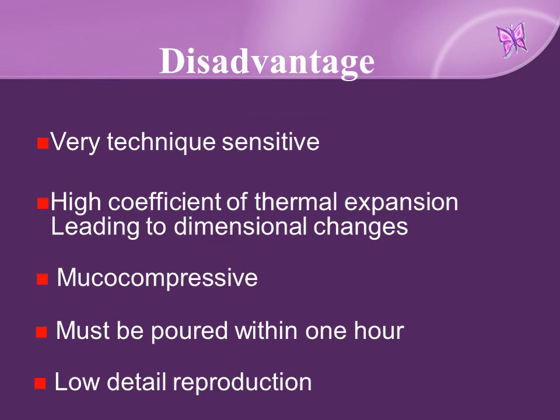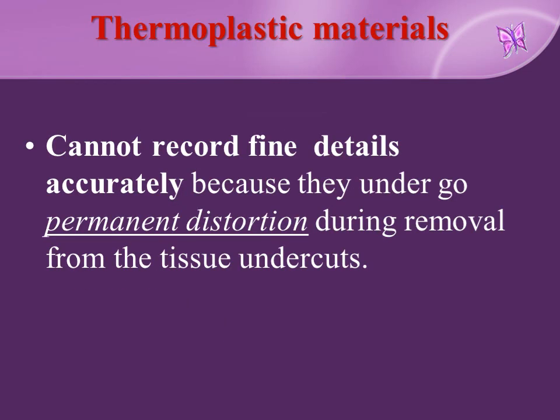Disadvantage: very technique sensitive. High coefficient of thermal expansion leading to dimensional changes. Mucocompressive. Must be poured within 1 hour. Low detail reproduction. Thermoplastic materials cannot record fine details accurately because they undergo permanent distortion during removal from the tissue undercuts.